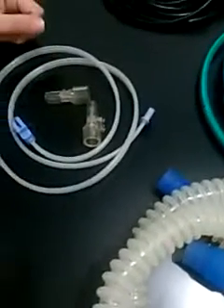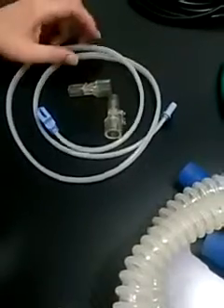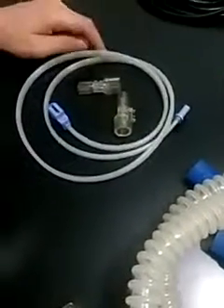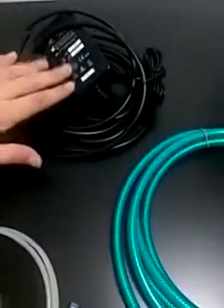Now I'm going to show you the standard accessories that you receive with your equipment. Normally, with each equipment you receive one breathing circuit, which is adult or pediatric or neonate, you choose, and it's a reusable circuit. Three flow sensors, 1 for neonate, 1 for adult, and 1 for pediatric, and also they're reusable. A flow sensor cable, an oxygen extension, and a power supply, power cable with inverter.